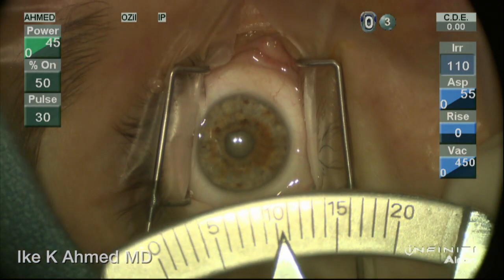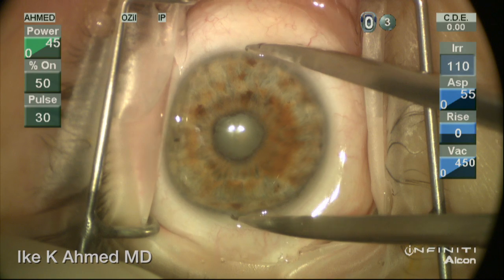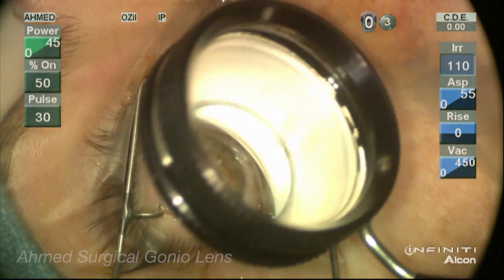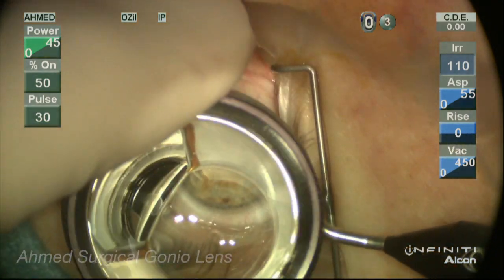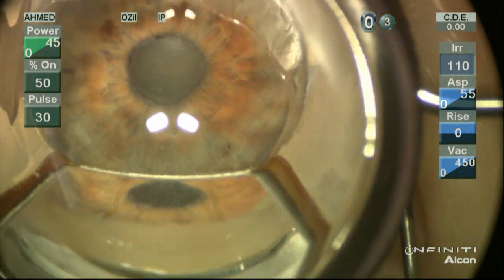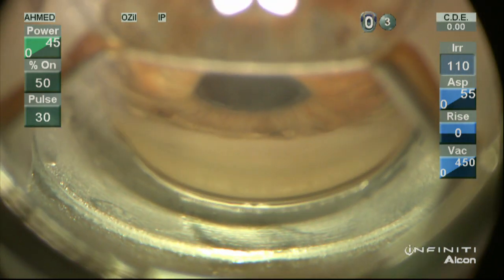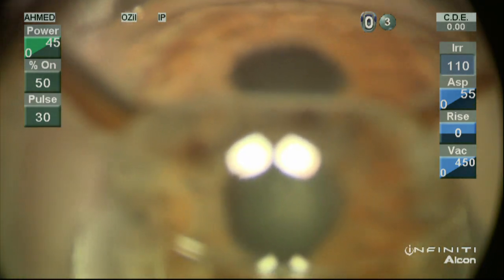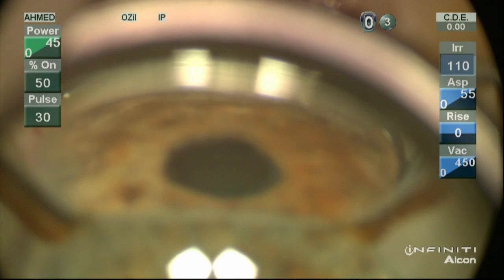This is a 19.3mm nanophthalmic eye with a 10.5mm white-to-white measurement, a lens thickness of 5mm, angle closure, and a moderately dense cataract in a small pupil. We're going to look at the angle first using the Ahmed Surgical Gonio Lens — a single mirror lens on a handle that can be rotated to visualize the angle. This shows angle closure with no angle structures visible in any quadrant. This patient presents with elevated pressures on multiple medications and a chronic history.